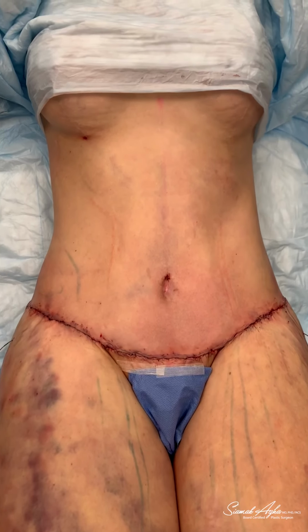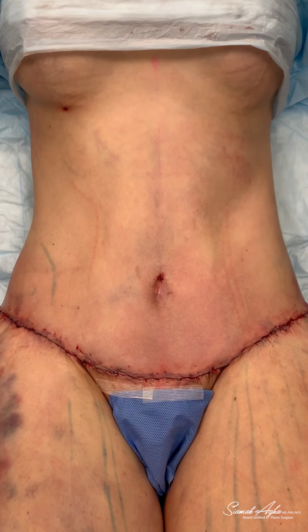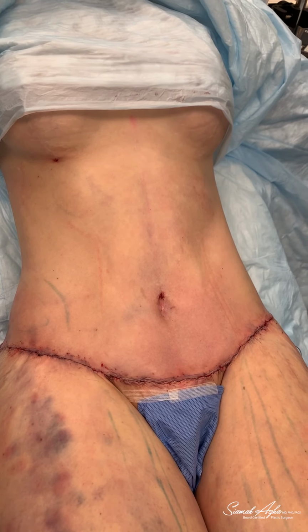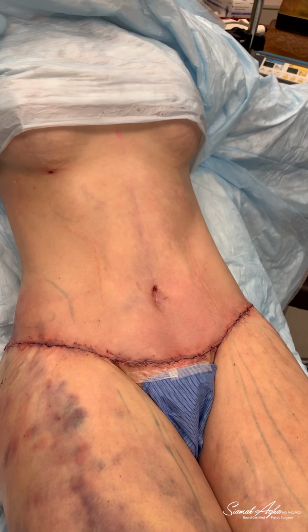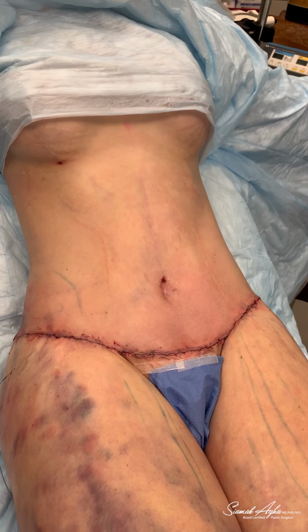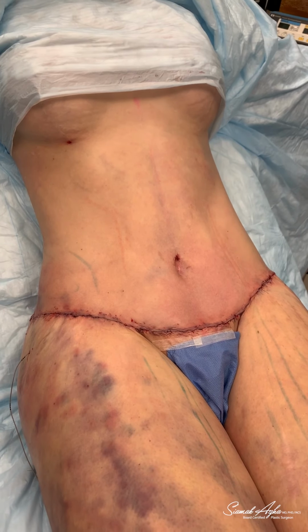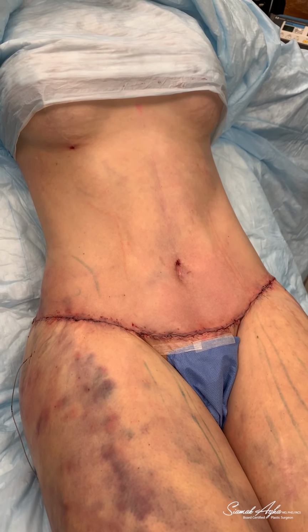So we are at the end of our case, and just look at that beautifully sculpted high definition tummy tuck. Her abdomen looks stunning, sculpted, defined, and toned after the liposculpture and her tummy tuck. In the process of her tummy tuck, I floated the navel, which means detached the navel from the muscle and brought it lower because her navel was too high.